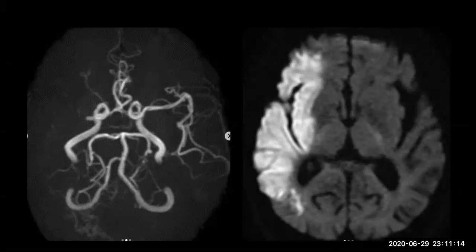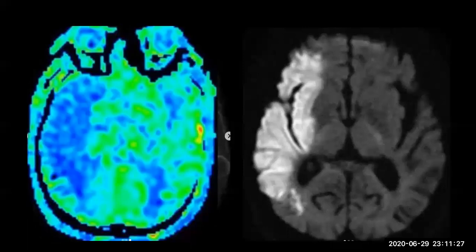Absence of the right middle cerebral artery, and here restricted diffusion in the corresponding area supplied by the middle cerebral artery. And this here is the perfusion. Do you do perfusion often, or not? No. This is the perfusion. We differentiate between the infarcted area and the non-infarcted area. It is very important, especially if you do the perfusion within 4 hours, because we want to give the patient a thrombolytic agent.